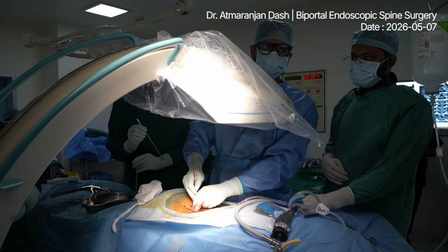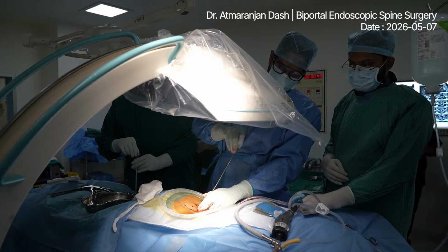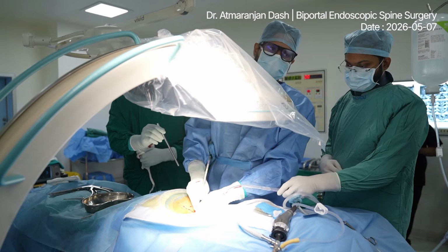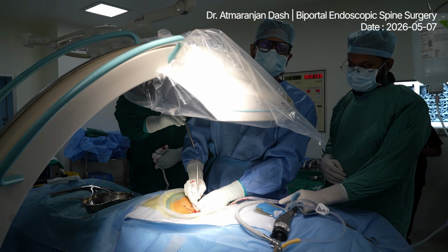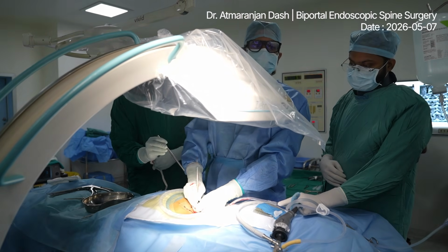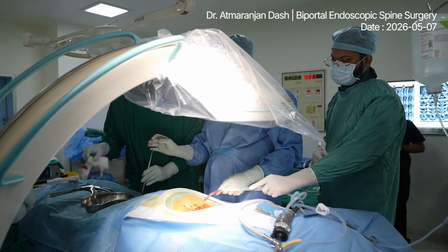Increase the height of the C-arm, shoot. So this is the foramen, you can see. I directly palpate the foramen, everything is in my hand. So we have landed on the TP and the foraminal area. Take a shoot again. Yes. So that will give a clear area for a landing point.